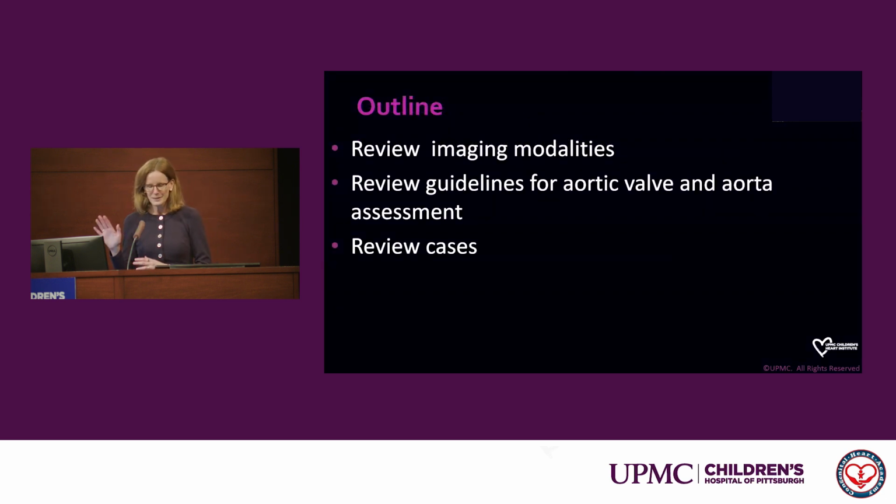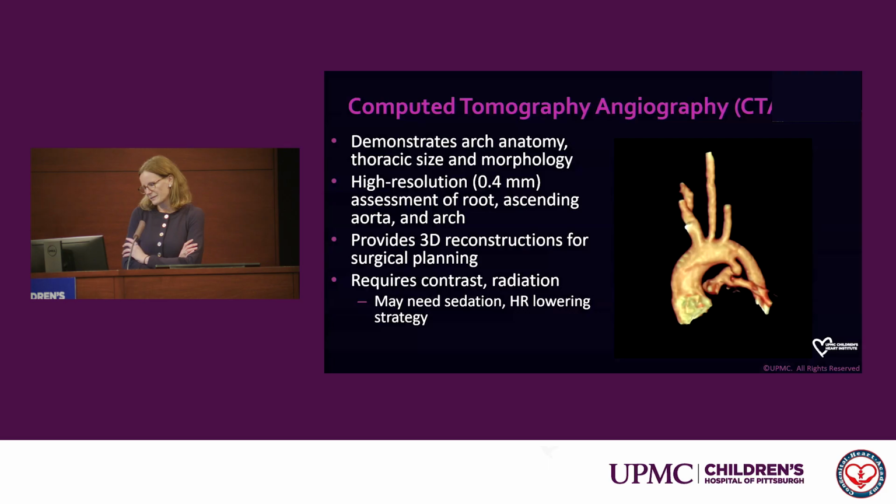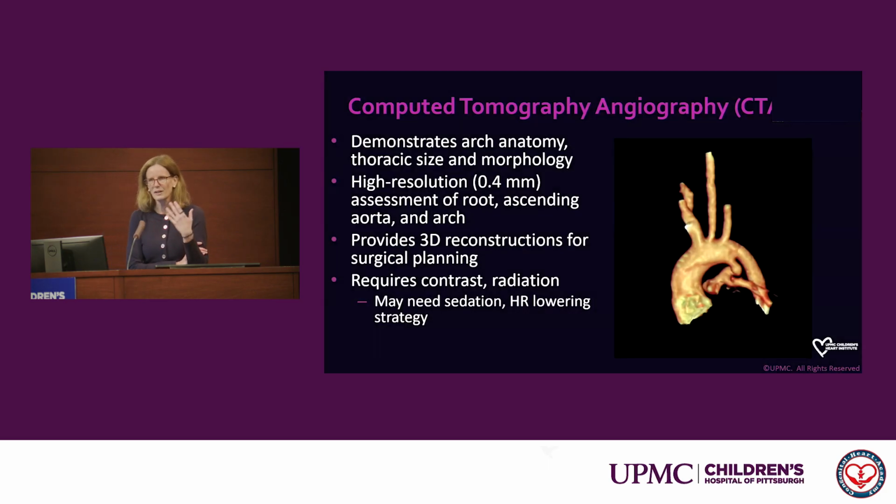We're going to briefly step through the imaging modalities just so we can understand what our options are for advanced imaging. We'll review some guidelines that are salient in the space, and then we'll review some cases. I think what first comes to everyone's mind usually when we think about cross-sectional or advanced imaging in aortic valve disease is CT.